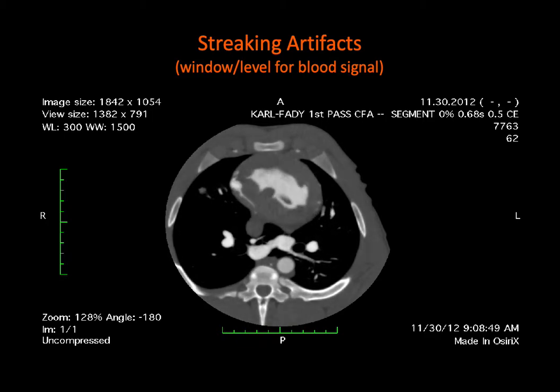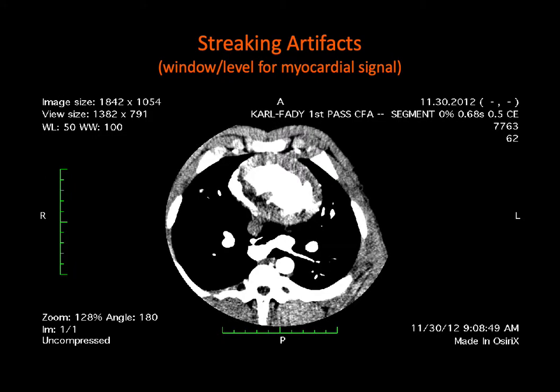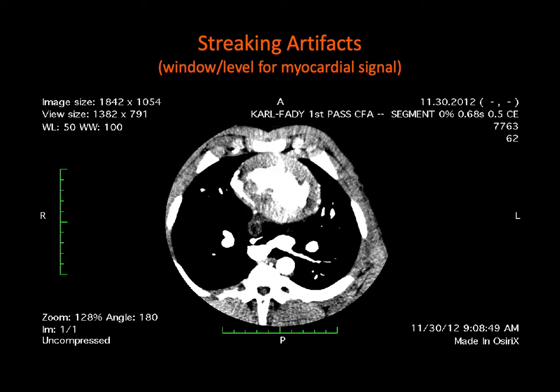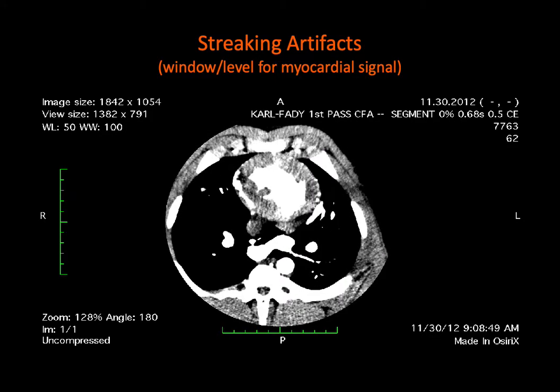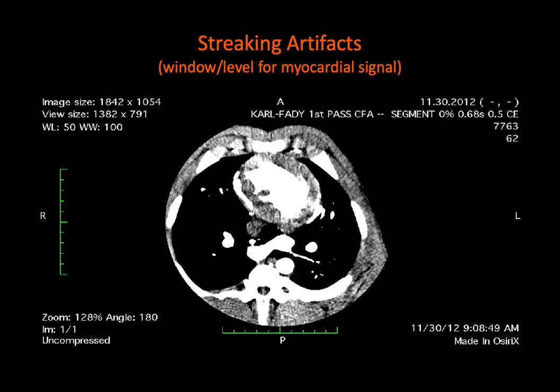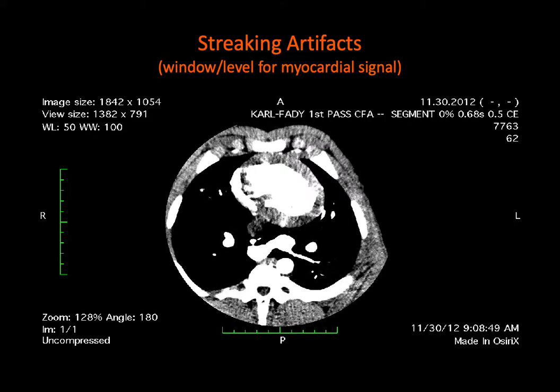Again, this contrast is not sufficient to look at the myocardial window. But you can see that there's maybe some flickering in some of the gray areas based on the gantry spinning around. And so that's if you change the leveling, the window level. Right. Why can I say that this isn't really a perfusion problem? What gives that away? Or what would be your apparent justification?